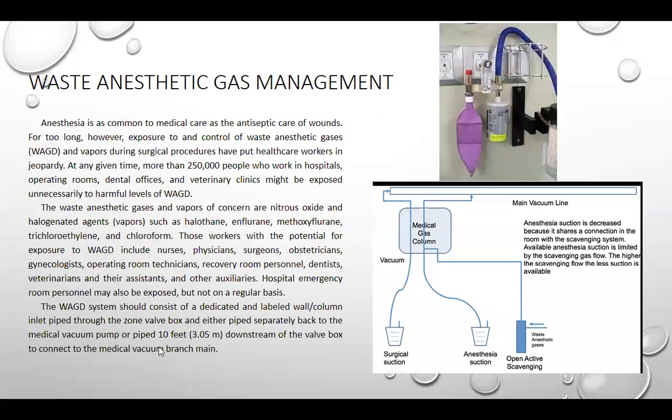Okay, next. Waste anesthetic gas management. Anesthesia is as common to medical care as antiseptic care. However, exposure to and control of waste anesthetic gases and vapors escaping during surgical procedures have put healthcare workers at risk of injury.